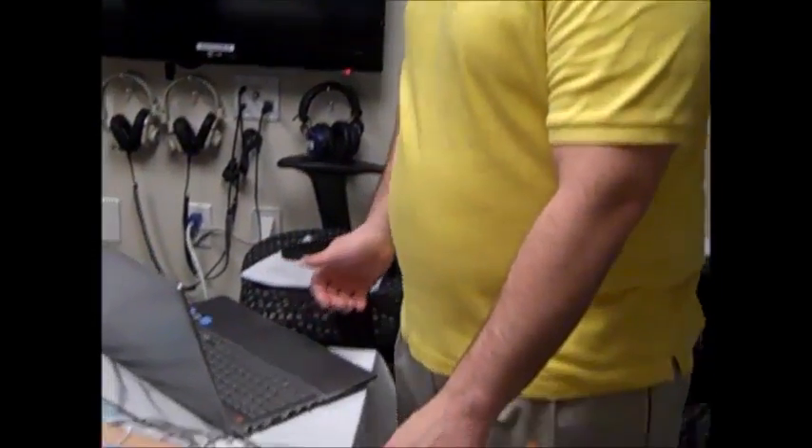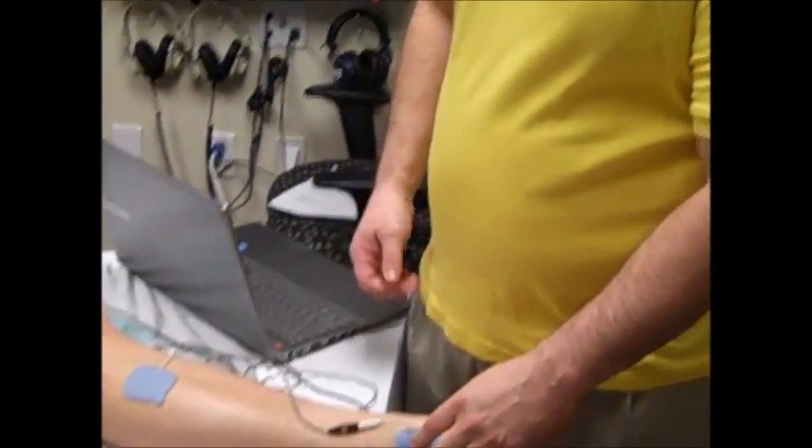This is to be a sensory parameter so that way they feel it and also get the benefits of the gate theory sensation to help with pain. The pulse rate should be about 120 pulses per second. The duration is as much as you can get, as long as they can handle without causing a muscle contraction, because right now that would be contraindicated. The active electrode is over the area where you want to get the most effect. From there, we're going to slowly turn up to where they get a slow sensory feel.